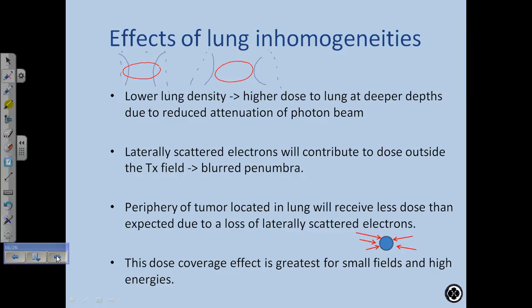But at some point, as you're opening your field size, you're treating above and below the tumor too, or treating more because your field size is bigger all over. So you need to watch out for that. And in some cases, you just tell the doctor that this is the best you can do. He needs to increase possibly the dose that he gives the tumor, or the prescription dose, or the hotspot.